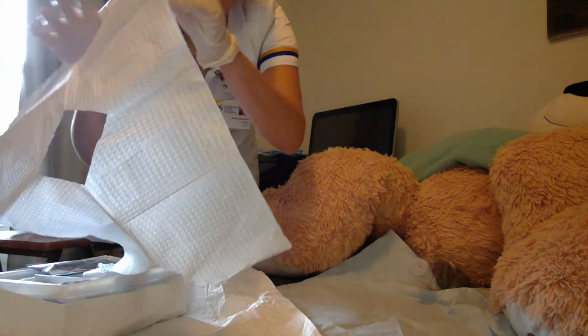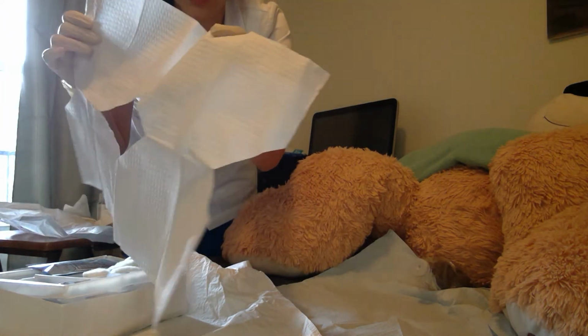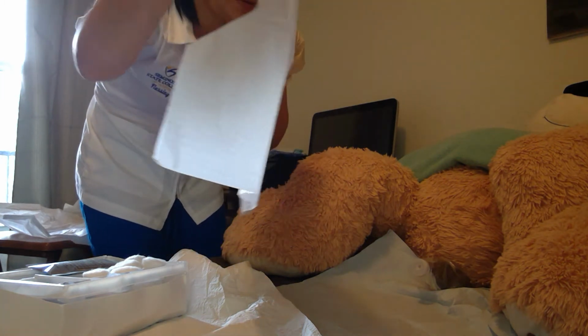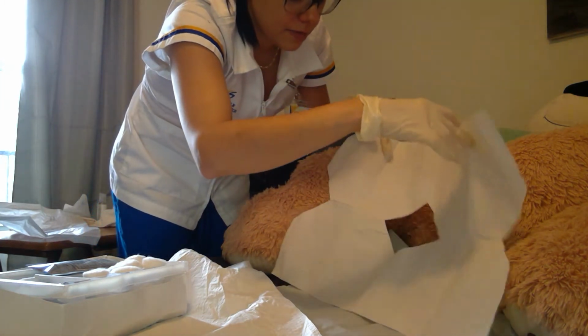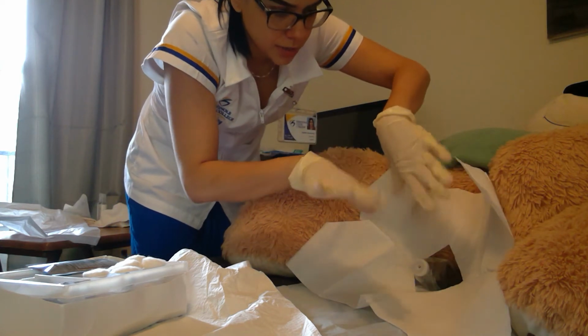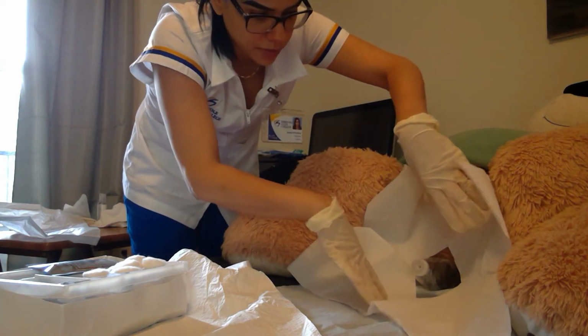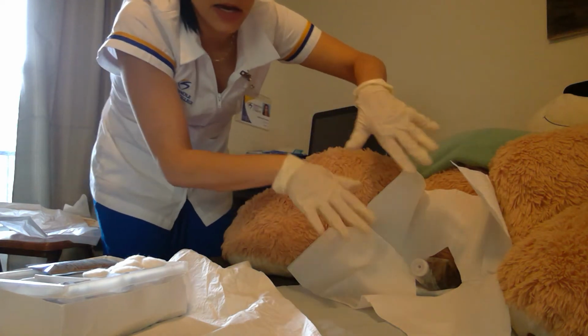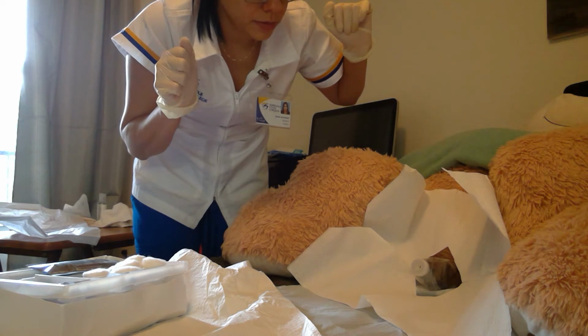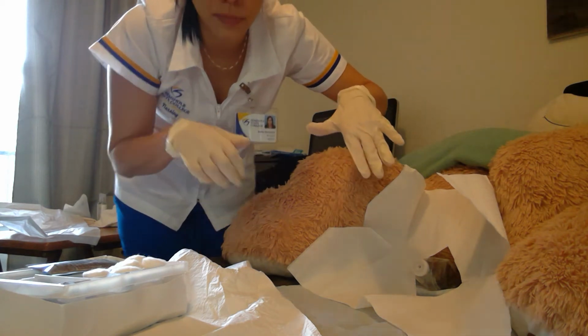Okay, and this is where I'm gonna put my patient's vagina, so I have access, and making sure I don't touch anything but my drape. Okay, so basically I have exposed what I need to work with.